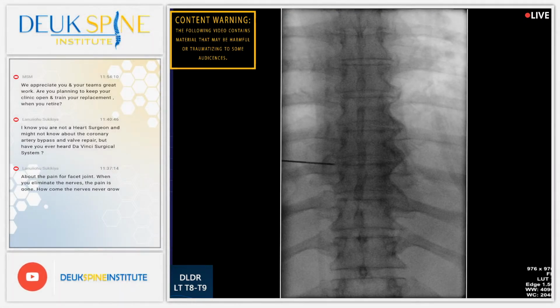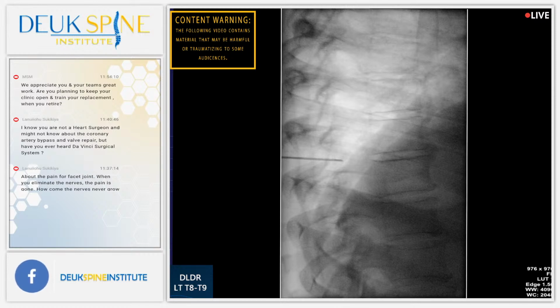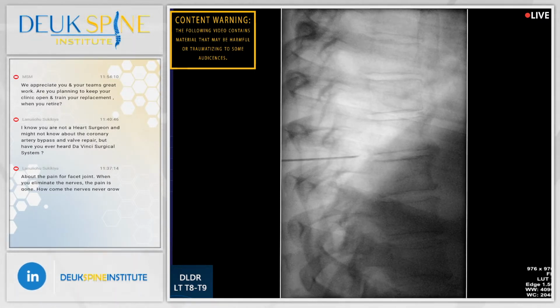We're more medial, but we're right on the facet. So it's kind of like the rib head and the facet are for some reason ganging up and blocking our access to the disc. It's just his anatomy. And it's not creating any way for me to get there. Shot? There's just no way around it.